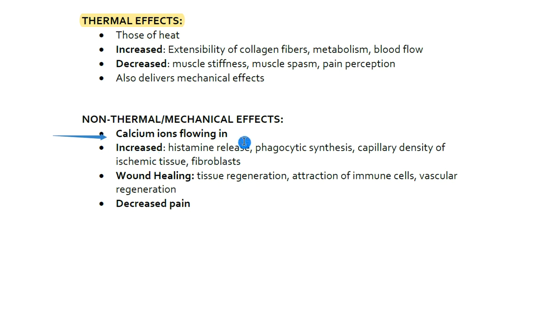You may get more histamine increased there, so that may help with the healing process. You may get more phagocytic synthesis. You may get increased capillary density. You may get more fibroblast production and other things here. And along with the thermal effects, non-thermal also causes decreased pain. So that is a good thing. Those are some of the effects that ultrasound has been shown to have.